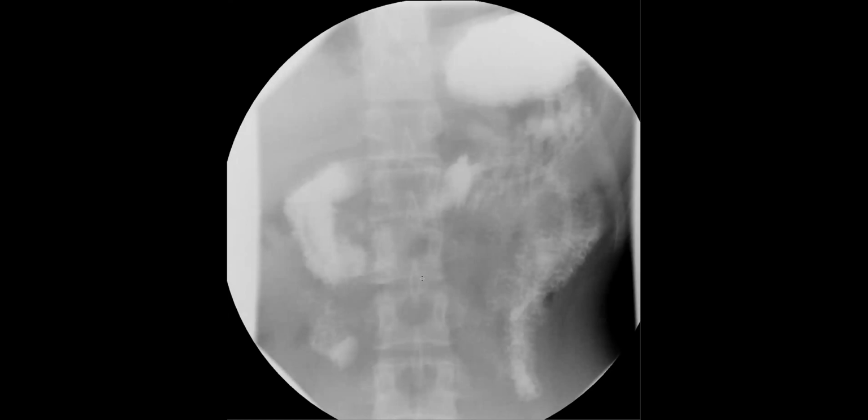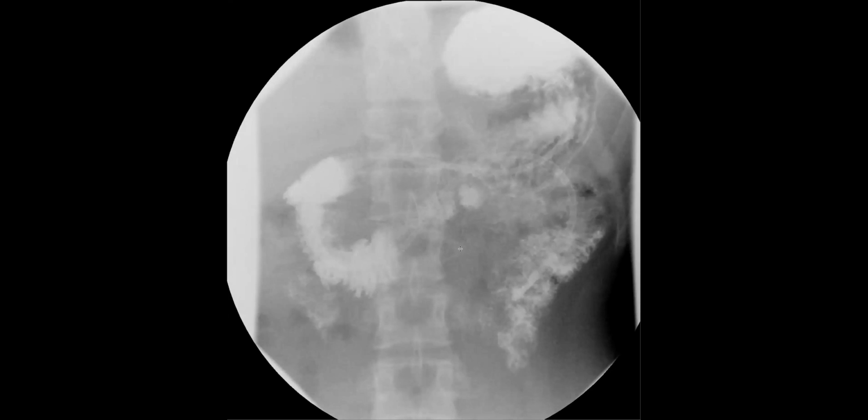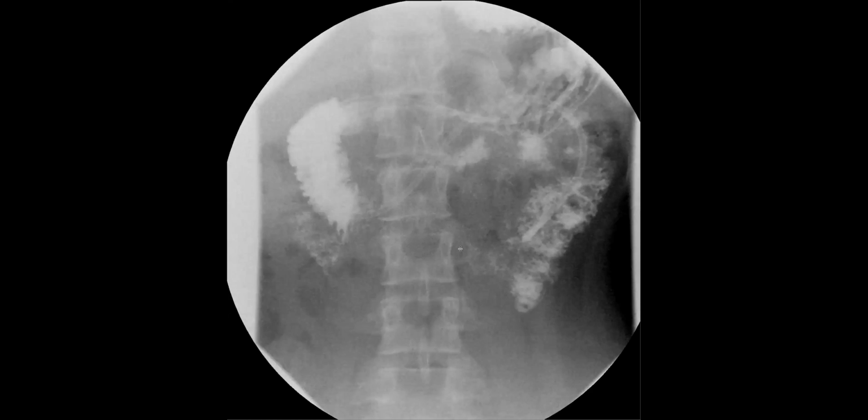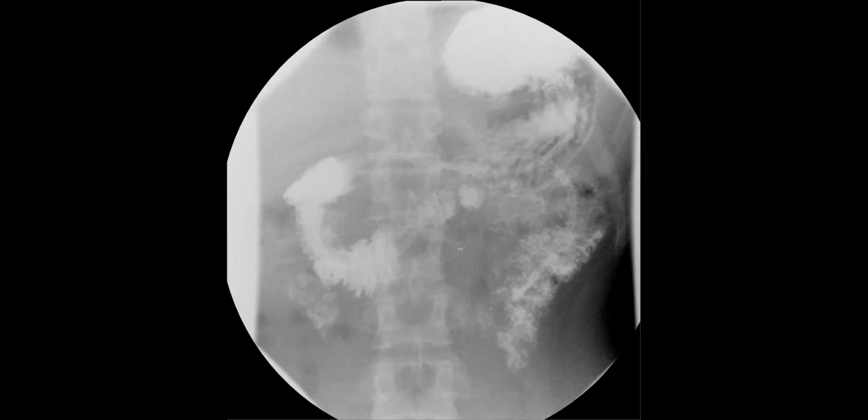After like 10 minutes and walking around. Nelly, if you go back one image. Yeah. That's a nice one. Go forward one. That's a nice one, right there, where you see a linear cutoff, right at the midline. And one of the techniques that supposedly is supposed to work, and has worked for me once, is when they're lying down, you see that linear cutoff, but then when they sit up and the SMA is off of the duodenum a little bit, it's supposed to release it, and some contrast can go through.